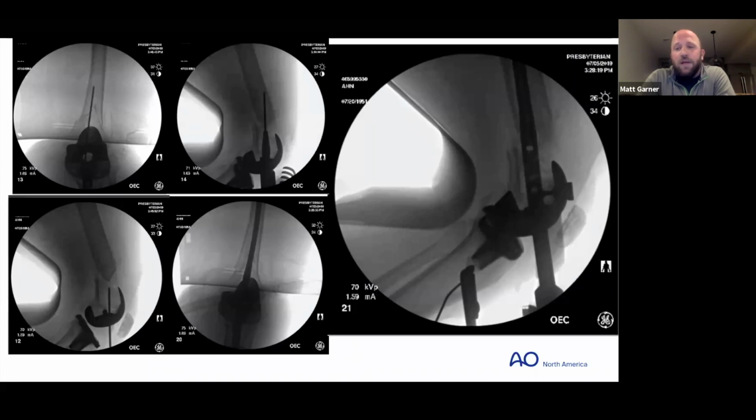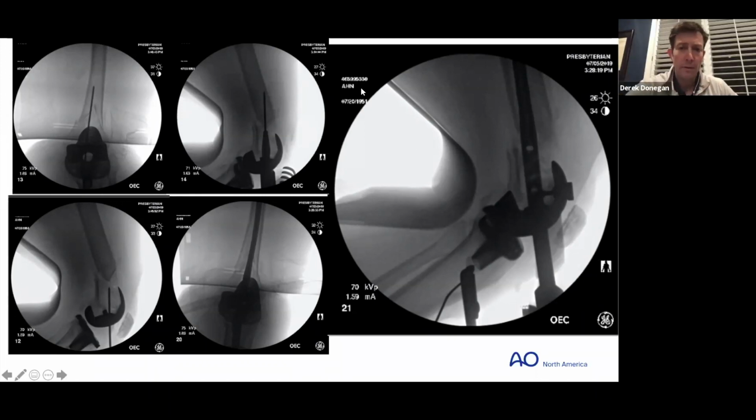But if you're going to nail a relatively distal femur, some people call it extreme nailing, but if you're going to do it, I think you have to be really comfortable with blocking or Poller screws. I would agree. John, what about you? Similar thought process? Pull the nail, cortical replacement screw?